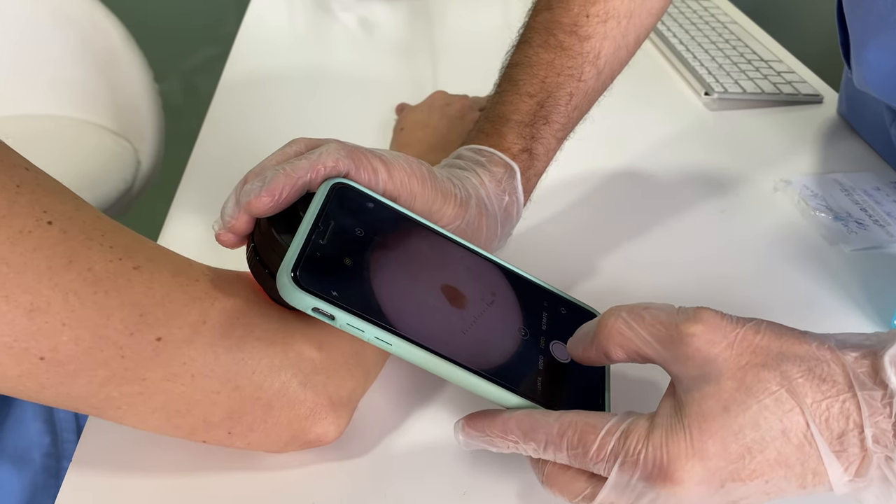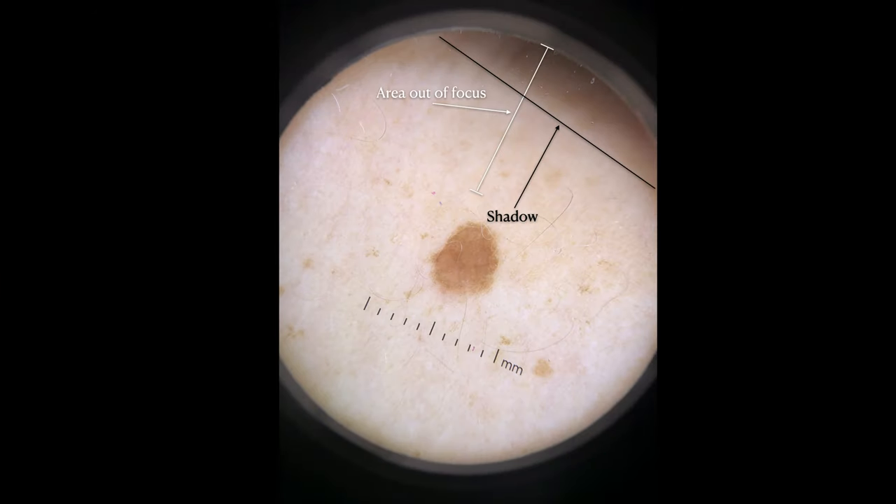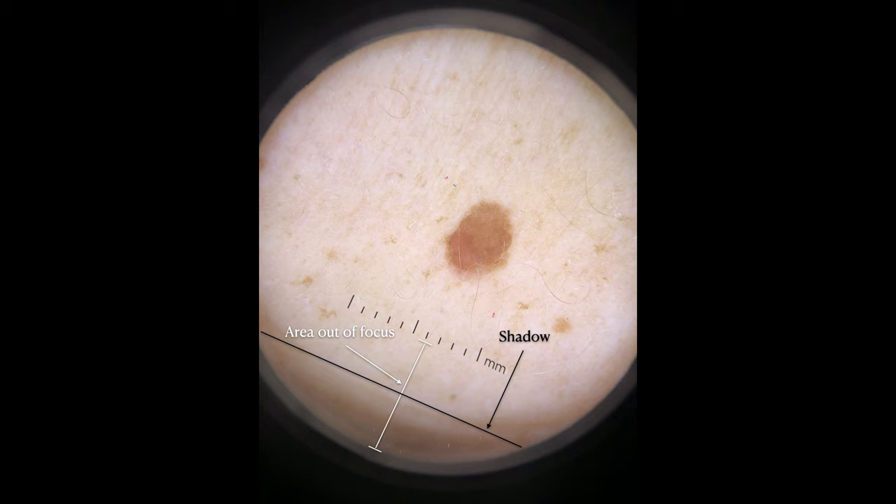In this first example, I produce an exaggerated backwards inclination of the dermatoscope so that we can see in the resulting photo that an inconvenient shadow is produced at the upper portion, and also that the area in focus gets dramatically reduced to basically just the center of the image. On the other hand, when I intentionally position the dermatoscope tilted forward, the resulting image gets a shadow at the bottom and again the area in focus is narrowed to the very center.